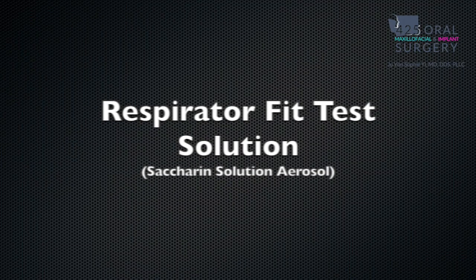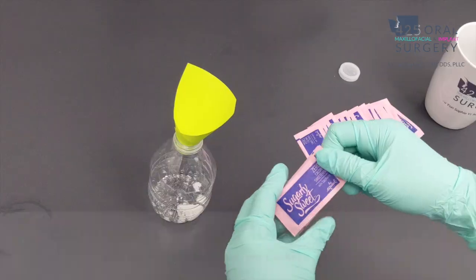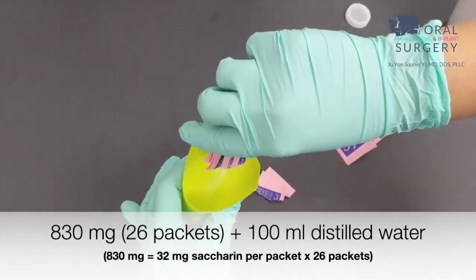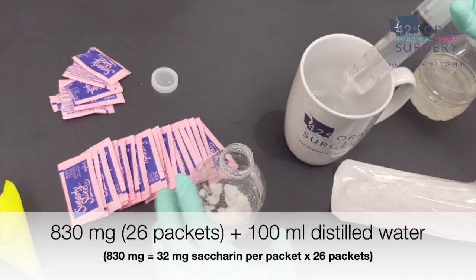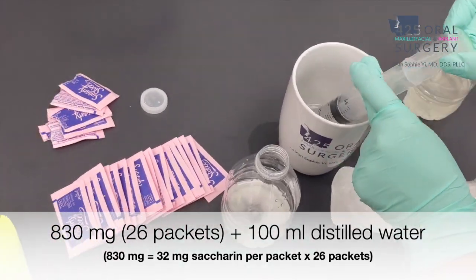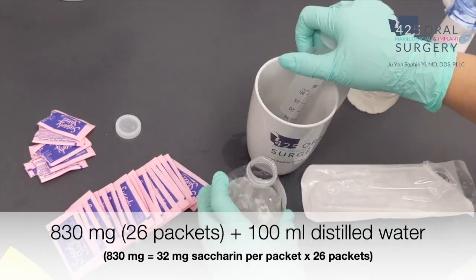We got a small water bottle and saccharine sugar packets to make the saccharine aerosol solution. This one had 32 milligrams per packet, and to make the saccharine aerosol solution we need distilled water to dilute the saccharine — that's about 26 packets. We recommend 830 milligrams with 100 milliliters of distilled water mixed together.